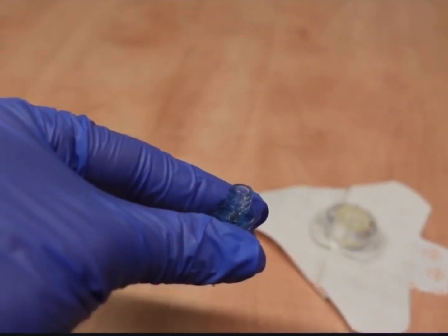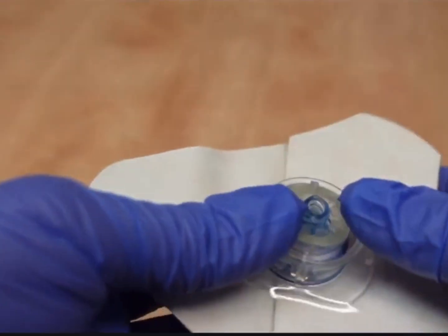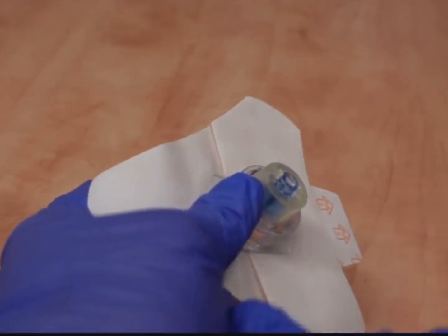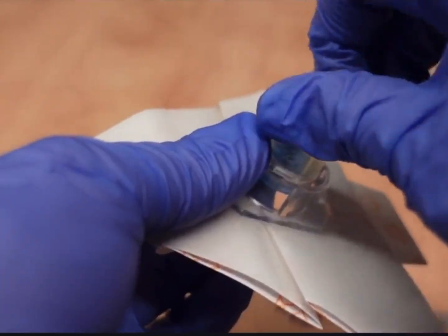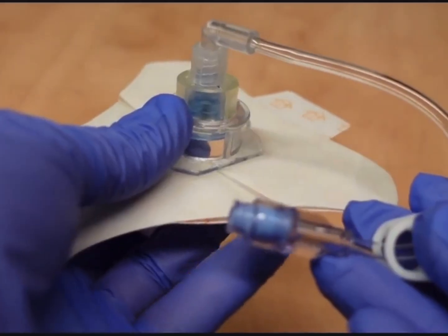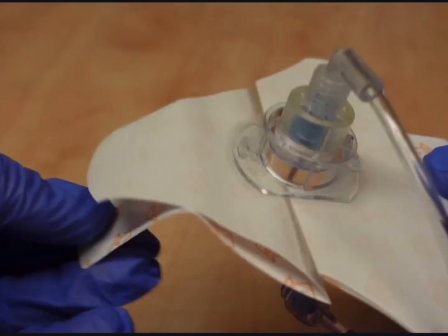Now this dressing here is going to go over top of the hub. You're going to attach your extension set. This is optimally when you're going to pull back to look for that bone marrow aspirate. And then you're going to flush. While you flush, you're going to be looking for signs of extravasation, any sort of signs of infiltration. This may be painful if the patient is conscious, so just note that when you flush, signs of pain are not necessarily a sign that it's not working properly. And then you're going to anchor your device down. Those flaps on the side peel away and the dressing will stick onto the patient.